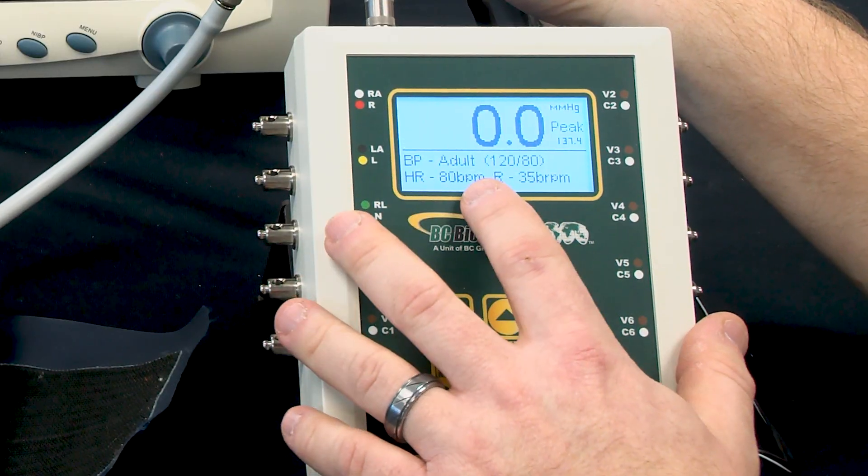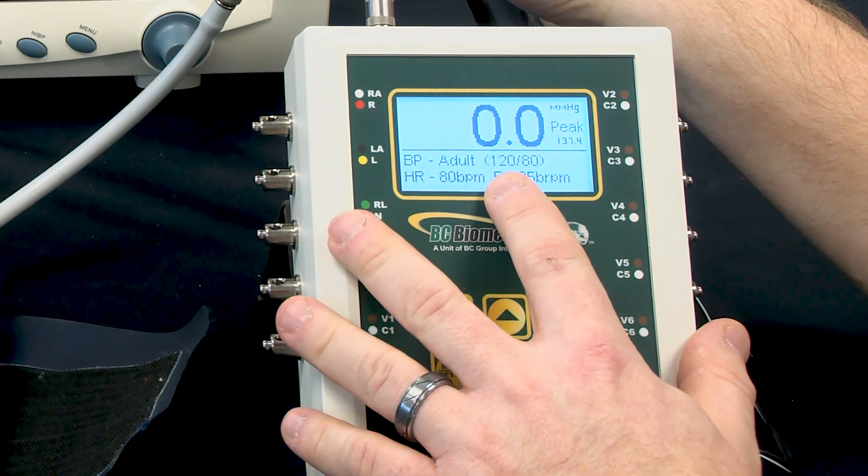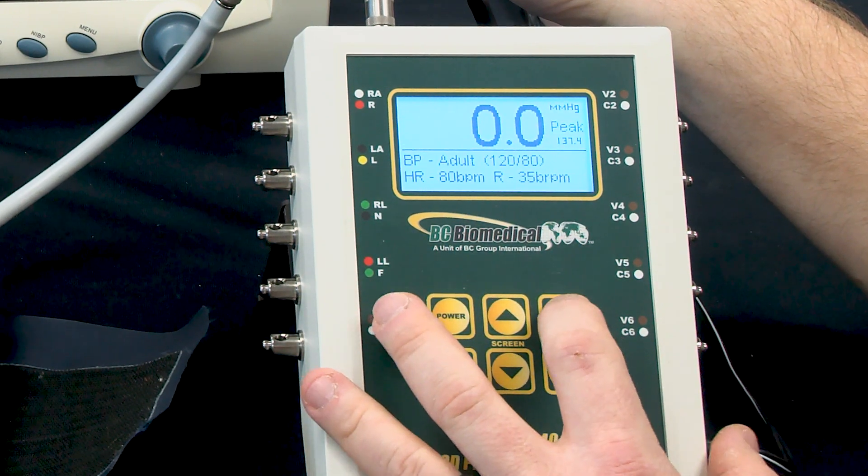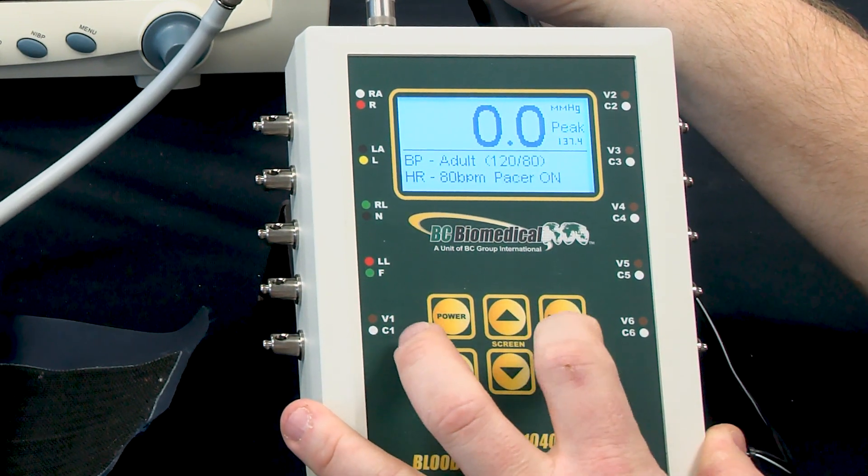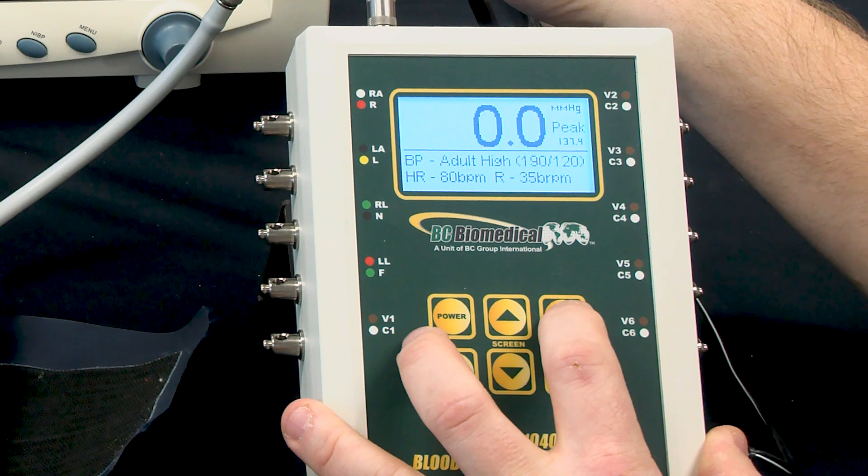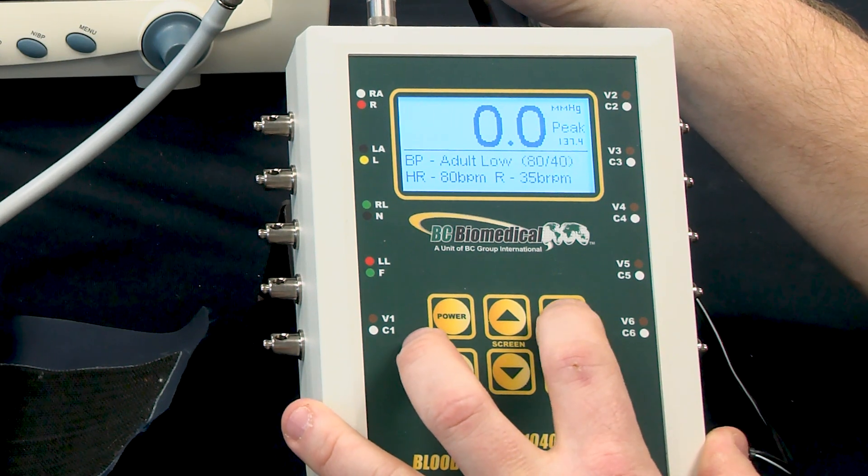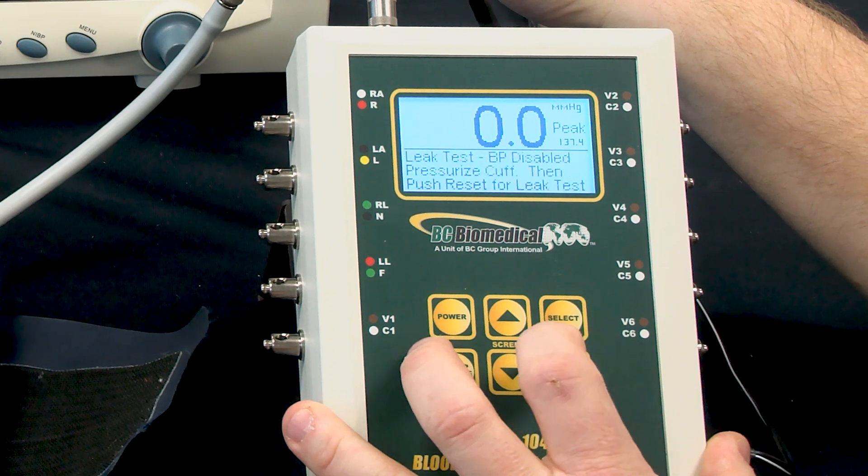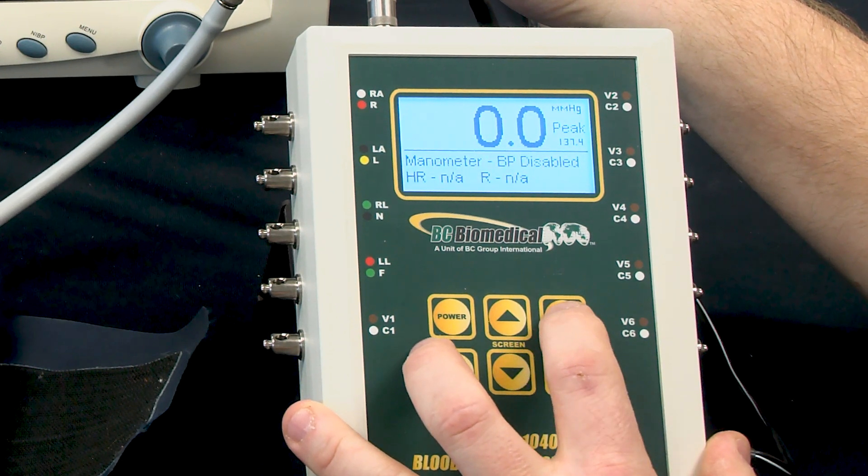By default, the NABP will start up with a simulation of 120 over 80 pressure. We can easily change that by selecting the press select button, and we'll cycle through all of the available pressures and simulation modes that are available on our NABP simulator.